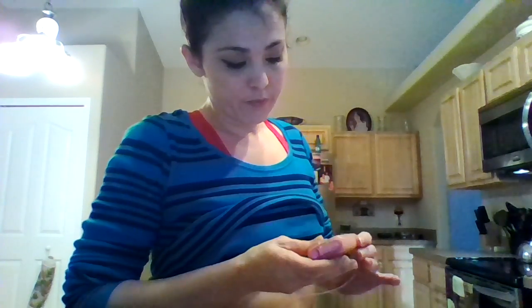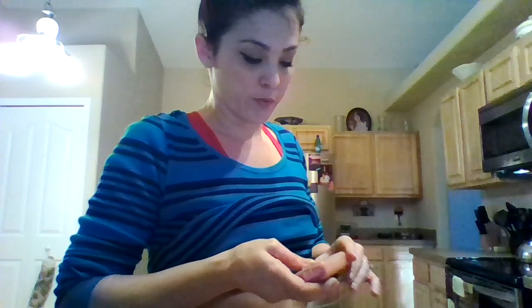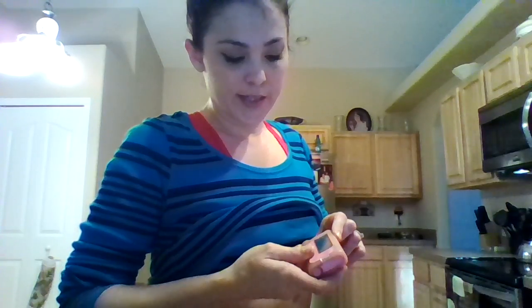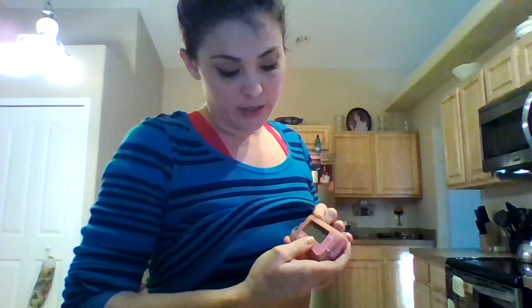So on my pump, I hit Act. Then I go down to Sensor. Hit Act again. At this point my sensor was off because I went a few hours without having one in. I choose the timing, but I'll touch on that in a minute. So I turn the sensor on. And then once I turn the sensor on, I have to go back to that sensor menu and tell it to link to sensor. So I click on link to sensor and I tell it I have a new sensor.